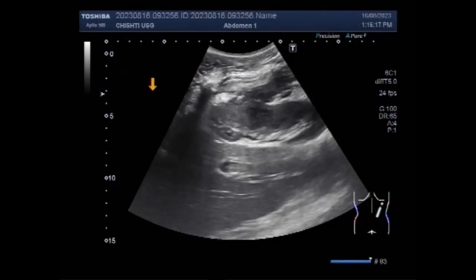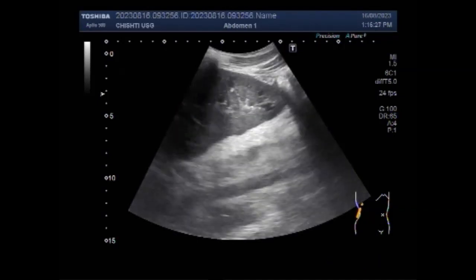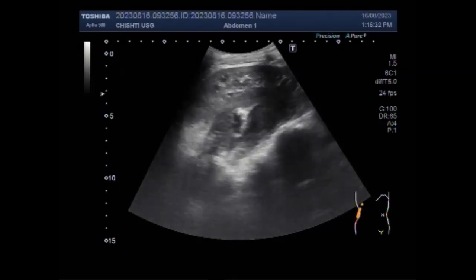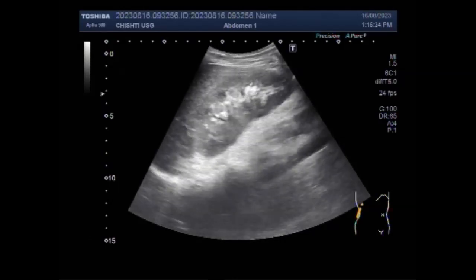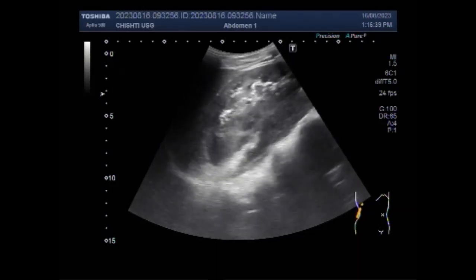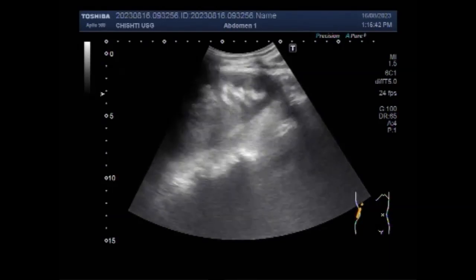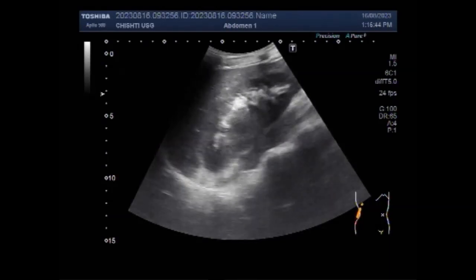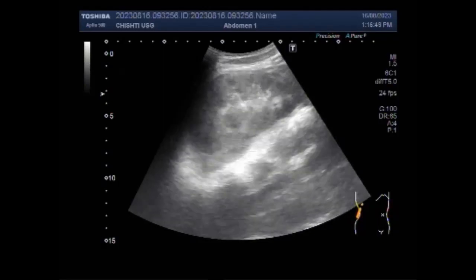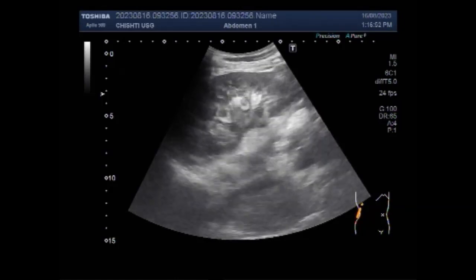You can see the right kidney, and it also looks normal. But when examined in the side-down position, you can now see the mass. So it is necessary to examine the kidney at different angles and different positions. Now you can see the kidney has a small mass in its central position.